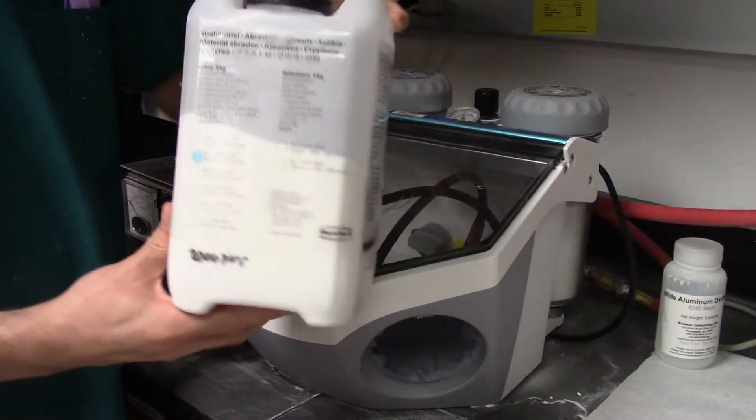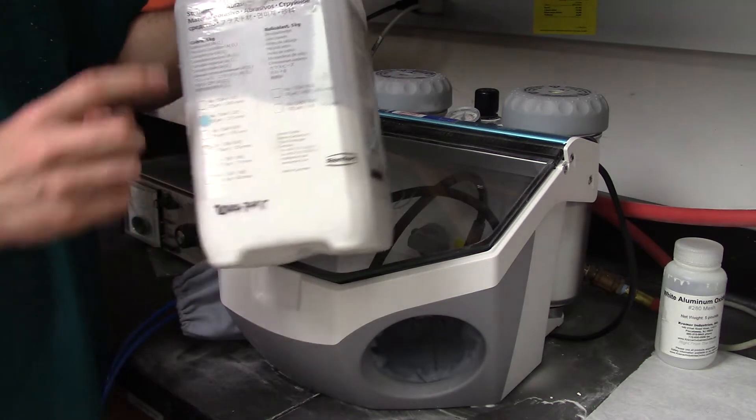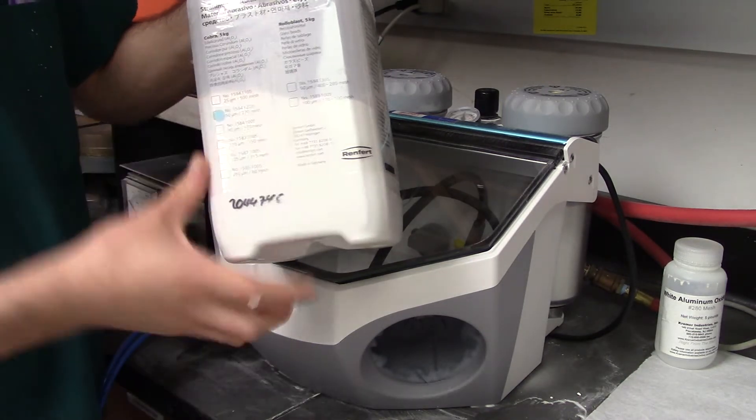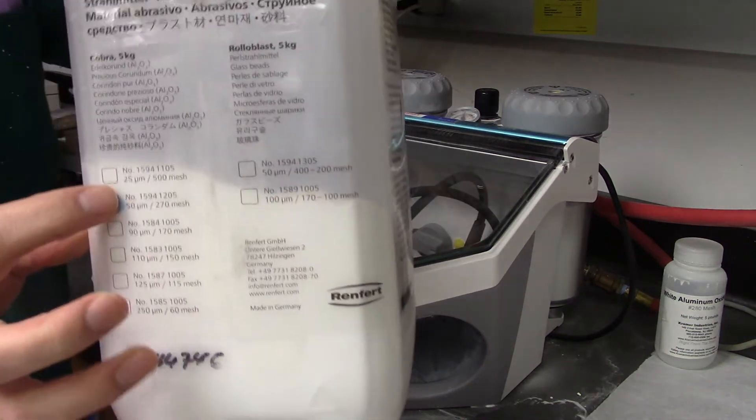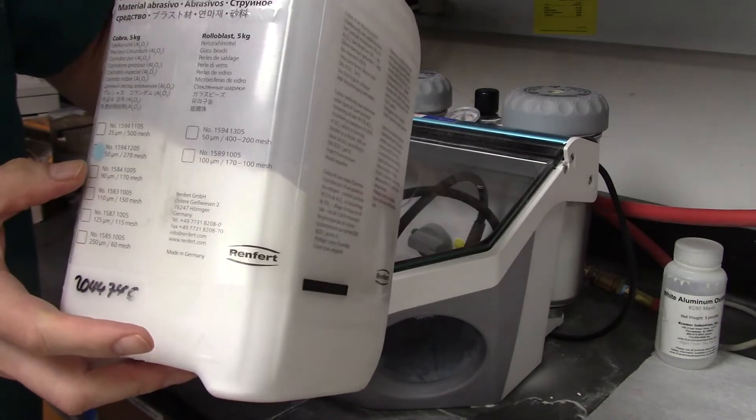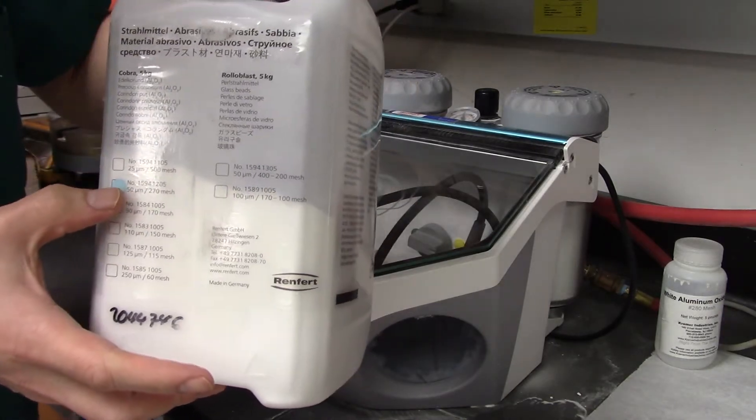We've got these jugs here. So this is a jug. And this jug, it says Cobra. Cobra is the alumina particles. You can maybe see right there, it's marked that this is 50 micron, or this one here, 50 micron alumina.